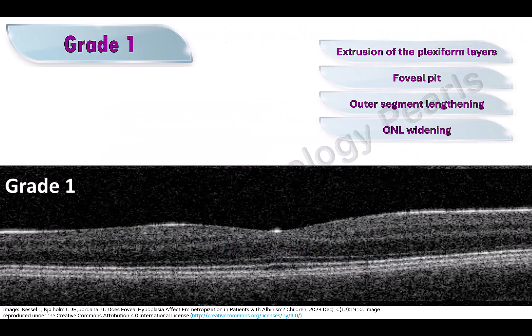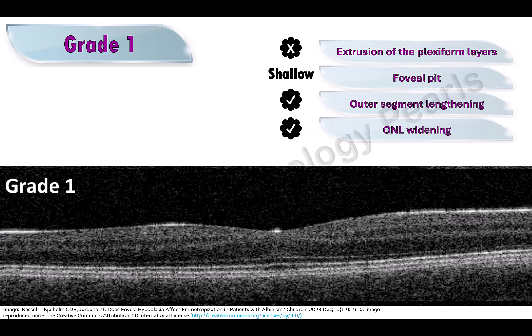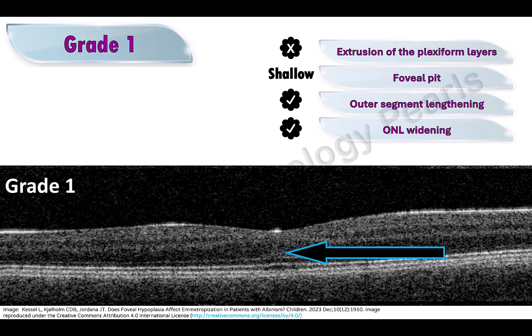In grade 1 foveal hypoplasia, complete extrusion of the plexiform layers is absent — you can still see them posterior to the foveola. This feature is present in all grades and the foveal pit is shallow. The outer segment lengthening and outer nuclear layer widening are present as normal. Here is the outer segment lengthening and here is the outer nuclear layer widening.